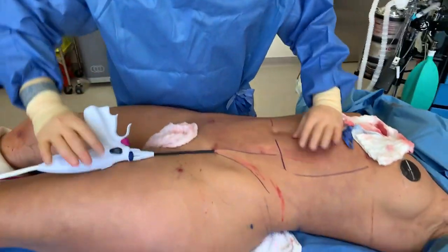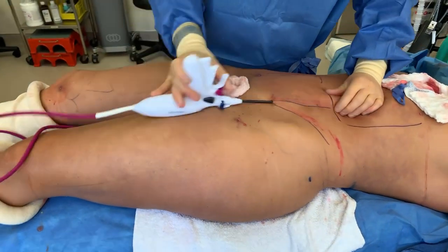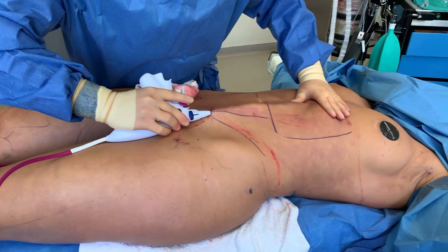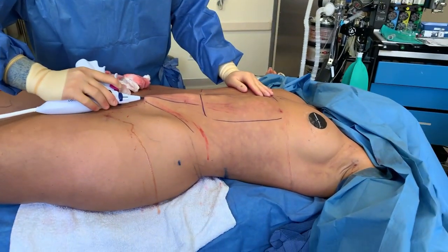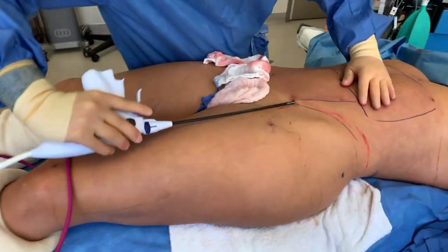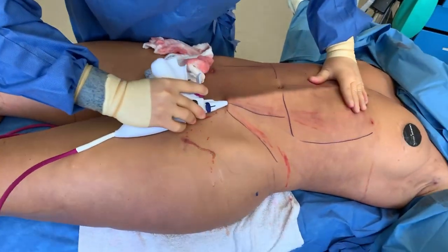What we're going to do now is just get her lower, then we're going to go to the upper. You guys can see we're going to go all the way up there — we really want to tighten this upper portion, everything from the midline.